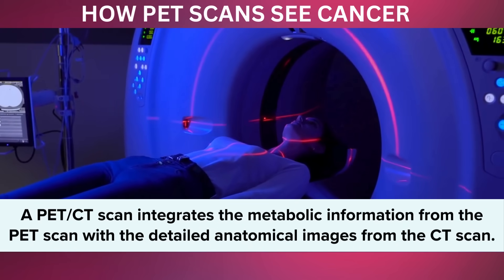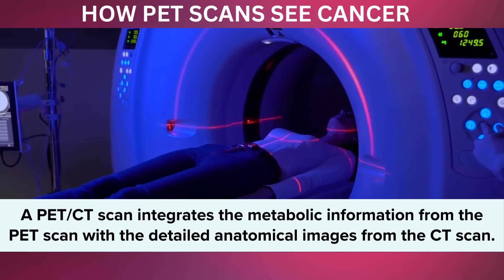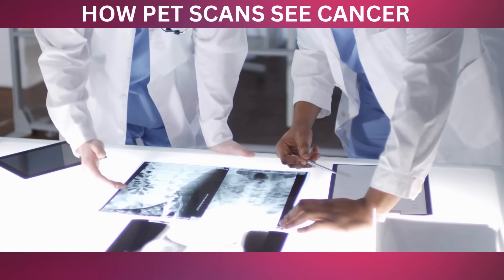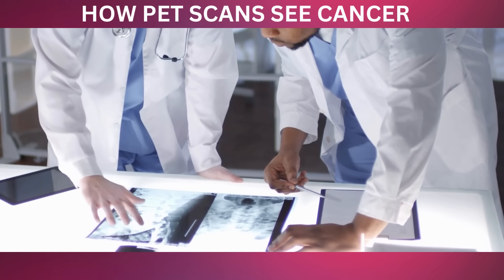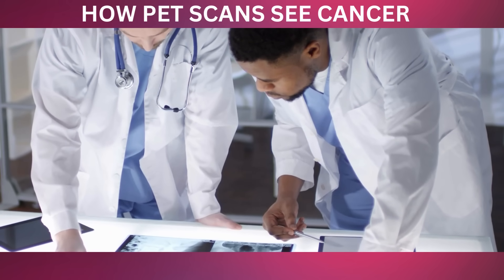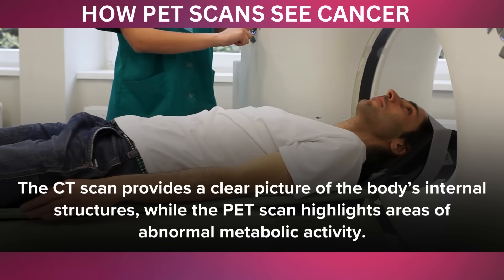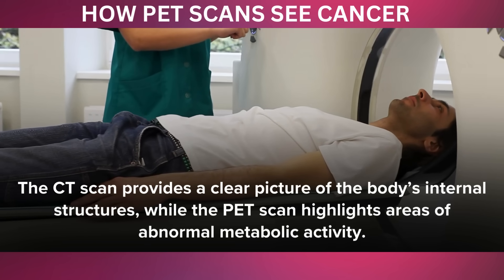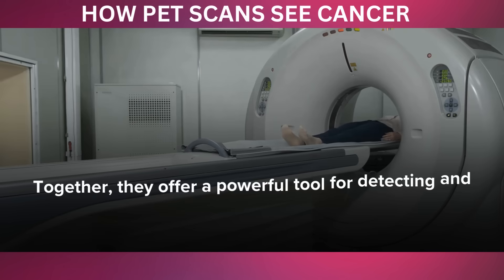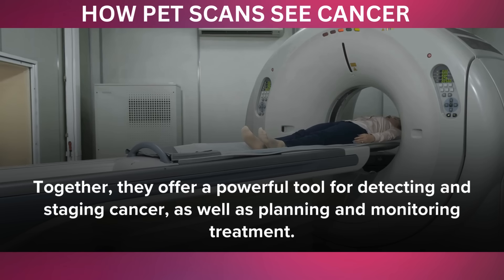A PET-CT scan integrates the metabolic information from the PET scan with the detailed anatomical images from the CT scan. This fusion provides a more comprehensive view of the body, enabling doctors to pinpoint the exact location of cancerous cells and understand their relationship with surrounding tissues and organs. The CT scan provides a clear picture of the body's internal structures, while the PET scan highlights areas of abnormal metabolic activity. Together, they offer a powerful tool for detecting and staging cancer, as well as planning and monitoring treatment.